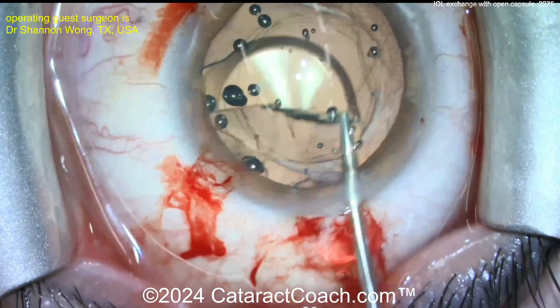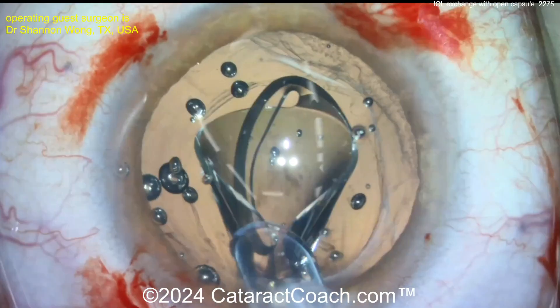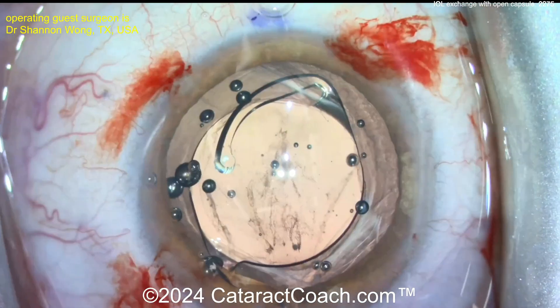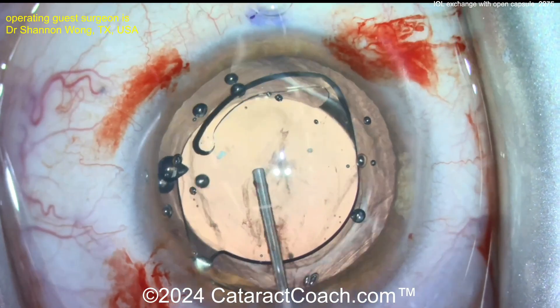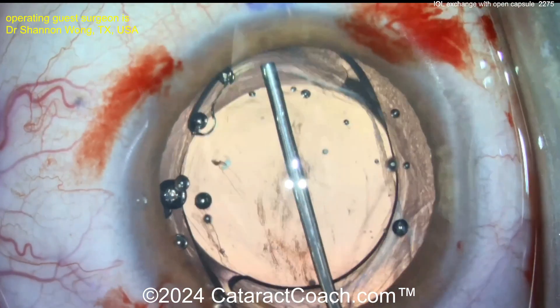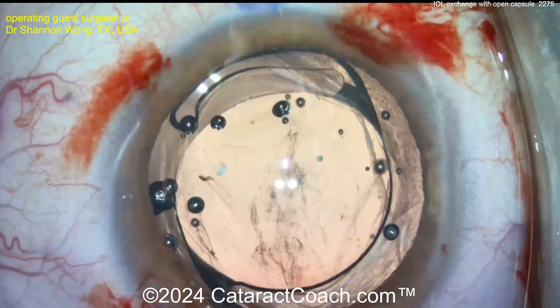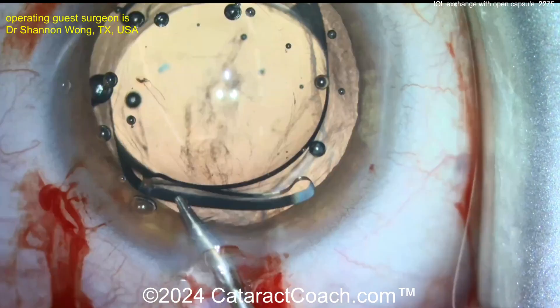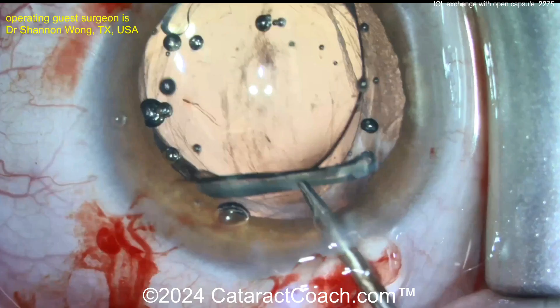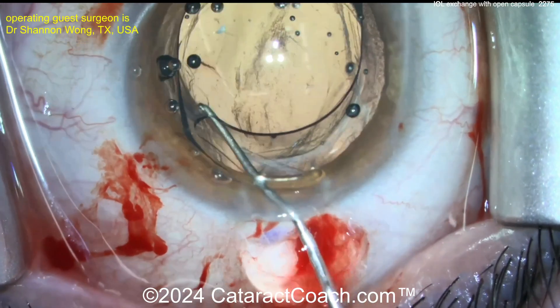Here's another case exchanging out a multifocal lens — cutting it in half or twisting it out, getting it outside the eye. Again you have an open capsule. Bring the new lens in slowly and place it in the eye. For Dr. Wong's technique, you want both haptics in the capsular bag behind the anterior capsular rhexis, and then the optic can be captured in front of the rhexis to get additional support.